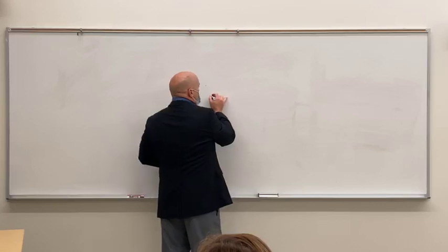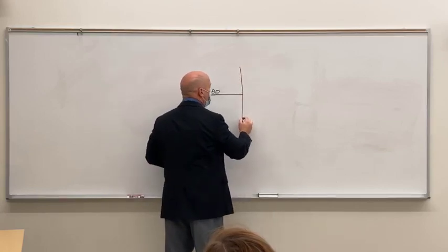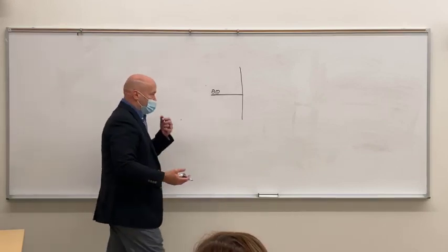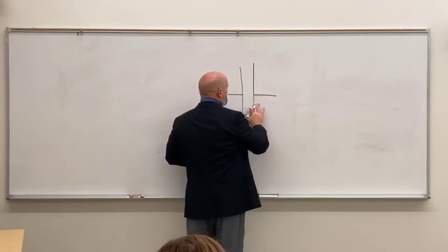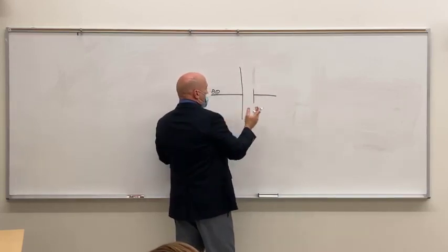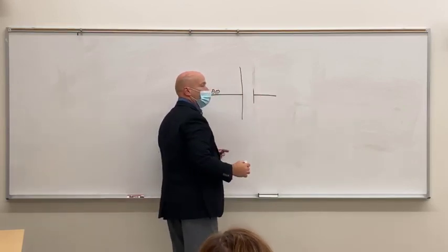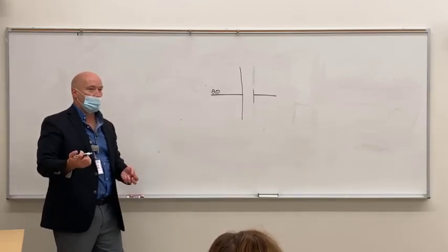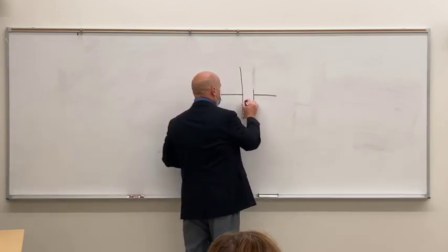So a capacitor discharge unit has electric flow into one side, and what you've got is a storage tank for electrons. You've got this great big plate, and another plate on the opposite side that may not even be as big, and it works kind of like a fuse. You've got an air cushion in between them so that the electrons cannot make that jump. So basically it's similar to your X-ray tube when you're in prep but haven't pushed exposure. The electrons can store up over here, so you have this collection of electrons.